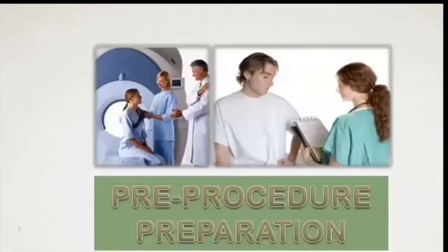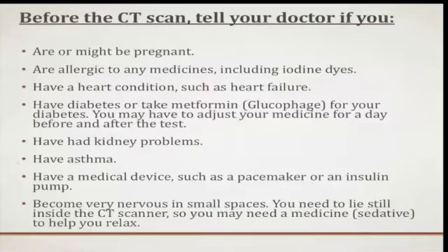So now that you're going to order your CT, now that you know which patients are more worthy of a CT and which patients are contraindicated, or let's say relatively contraindicated, we need to know how a CT is typically prepared for a patient.